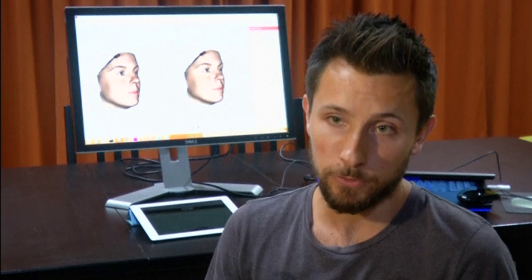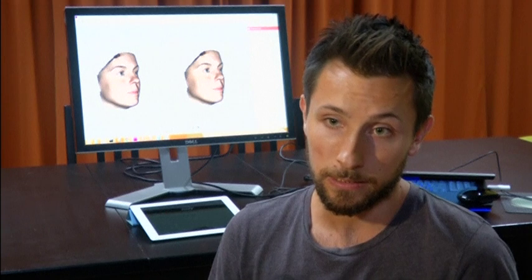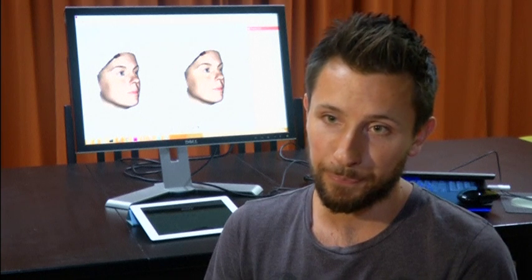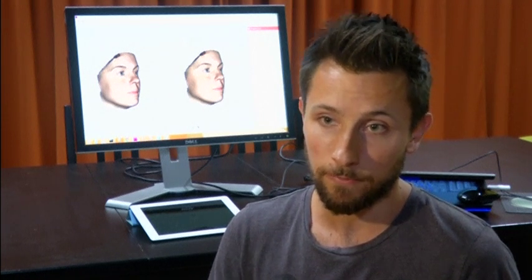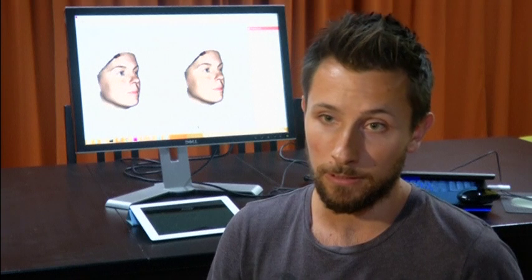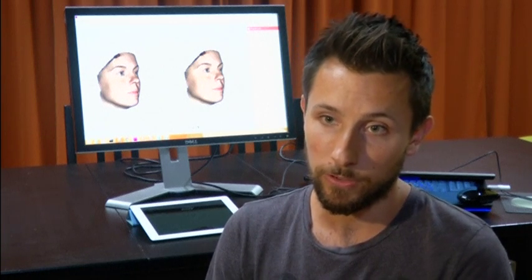Yeah, that's quite bizarre. Go ahead and take it off. This is for patients who, most of the time due to cancer, had to get their nose taken off, and so they need a nose prosthesis, in fact. The software can also look at the same characteristics of the face and use that to calculate a nose that is fitting for this particular face. The software won't make one general nose for all. It will make a characteristic nose which you can still alter towards the needs or the wishes of the patient.